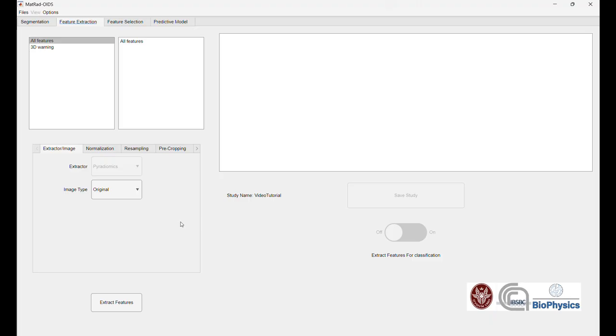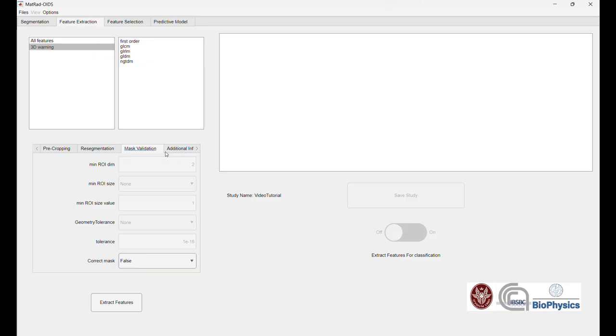The tool provides the option to either extract all the features from the images or to avoid extracting the shaped-based ones. This was done due to the size limitation of the Python library. In fact, for big images, the shape-based features can take hours to compute or crash the code altogether. For this reason, a warning was included alongside the possibility of avoiding those features altogether.